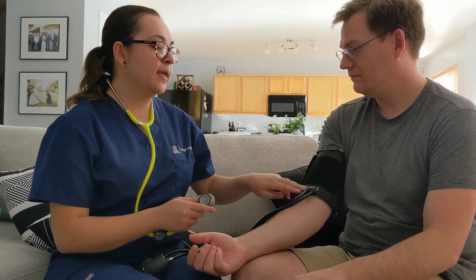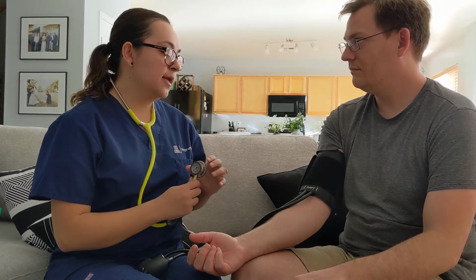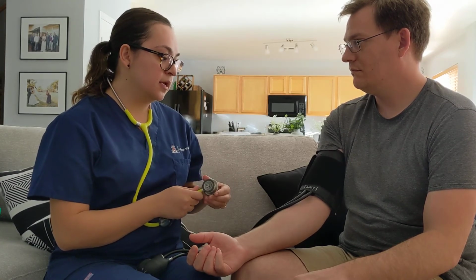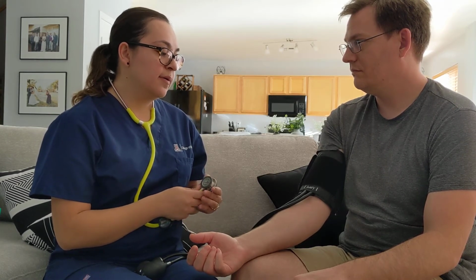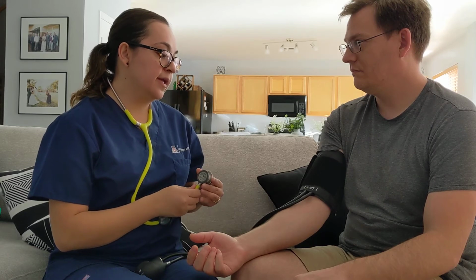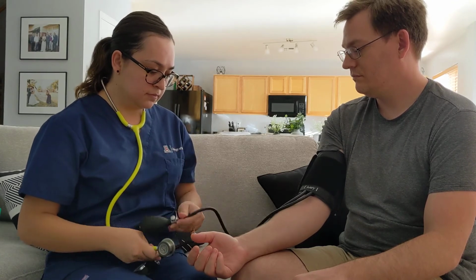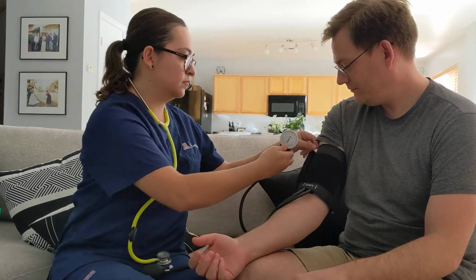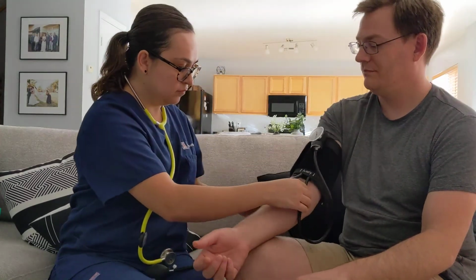I'm going to palpate his brachial artery, and then I'm going to inflate the cuff until I can no longer feel the pulse, and this is going to give me an estimated systolic number. And then I'm going to continue to inflate the cuff about 30 millimeters of mercury above that number to make sure I don't miss the auscultatory gap that some patients have. And then I'll take his blood pressure.